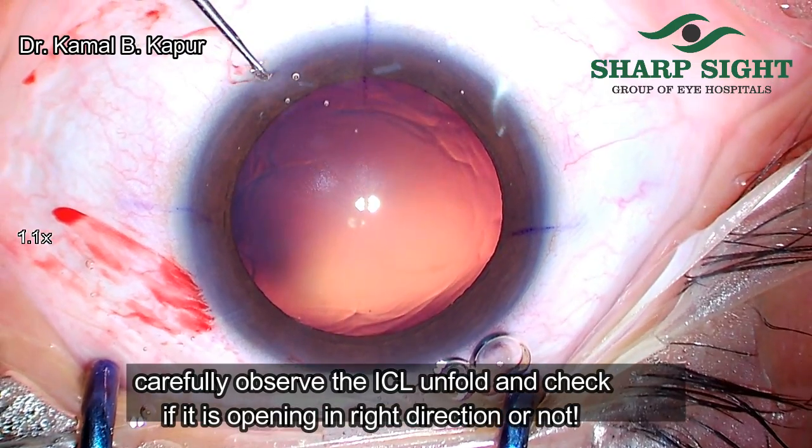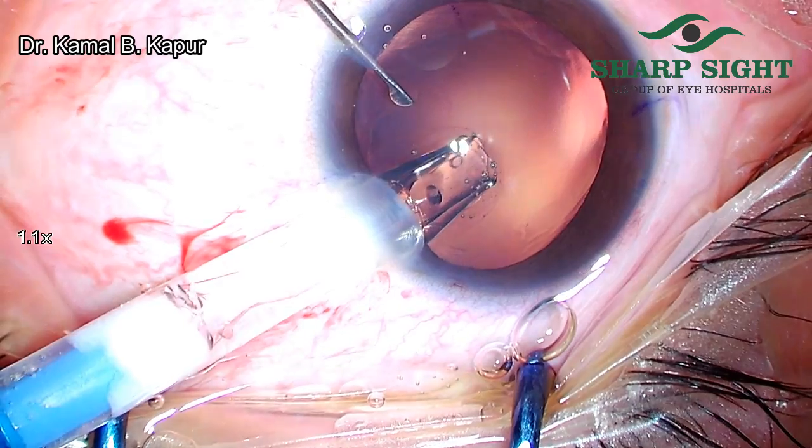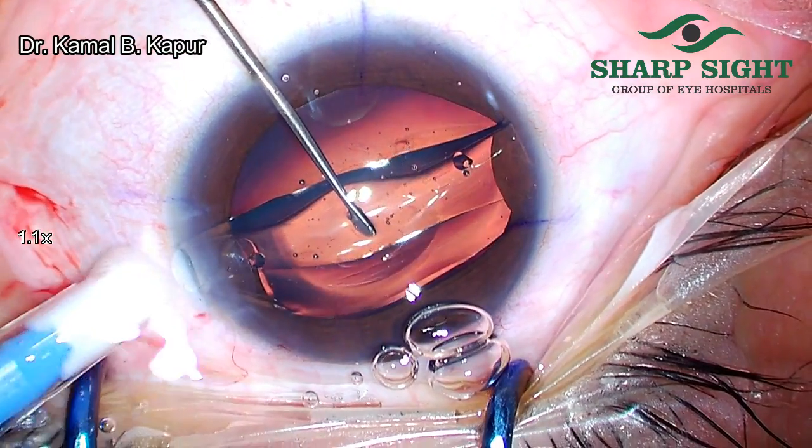Now, as we are getting ready to inject the ICL within the eye, we have to be very careful and notice how the ICL opens. Like in this case, it is opening vertically and upside down. Stop!